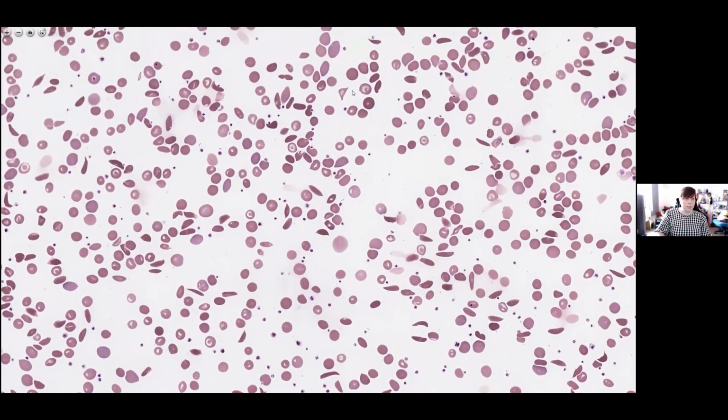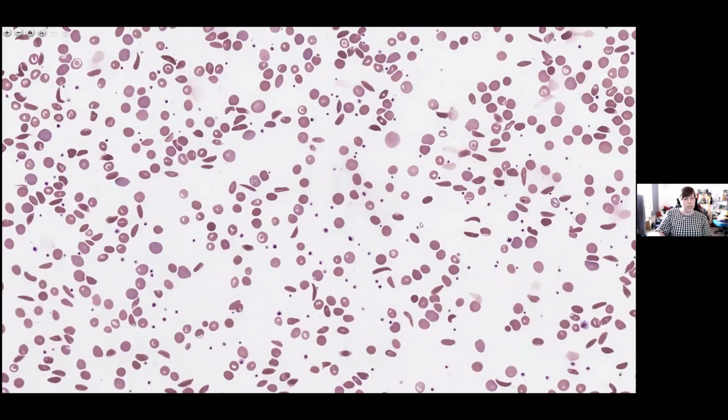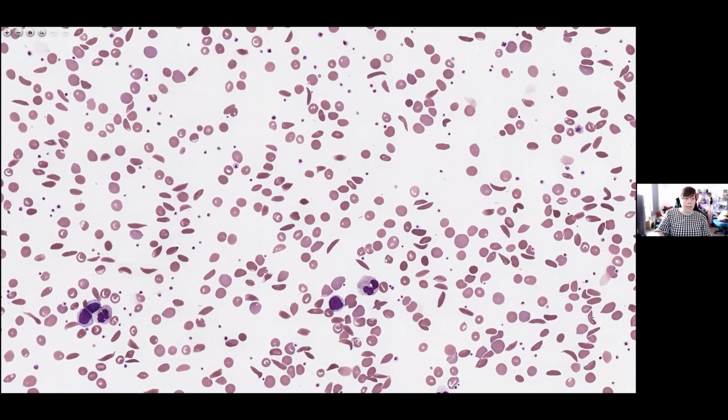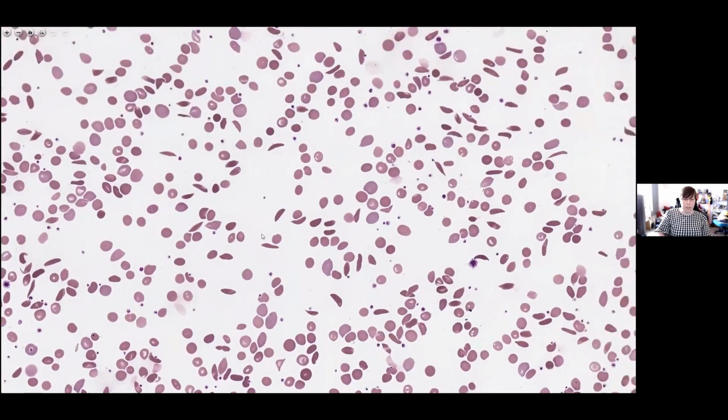As for the rest of the field, the white cell count was in the normal range, which is not unusual. There is a little bit of toxic granulation or hypergranulation in a patient with acute chest syndrome where there's obviously inflammation going on. That's not unexpected. And in the platelets, together, looking at hyposplenism again, we do have some quite large platelets that are floating around.